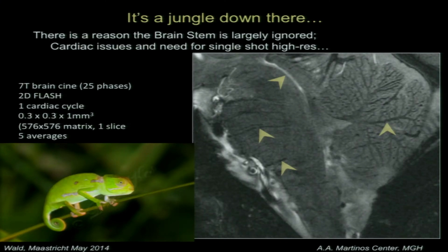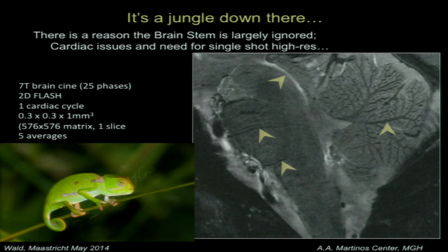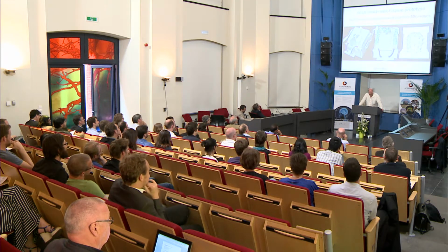And if nothing else, you clearly see that you have to avoid the CSF. The CSF is the enemy down here. It's got huge variations. If you're doing resting state, it'll drive phony correlations. It's just bad news. So I think some of these sea monsters are really kind of petite. They're not as bad as we feared. And we can probably travel down here without being eaten, unless we're a fly.